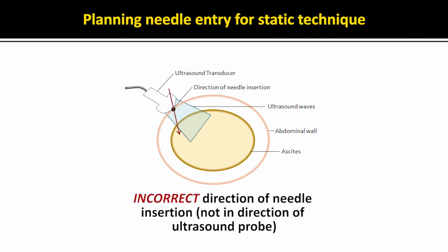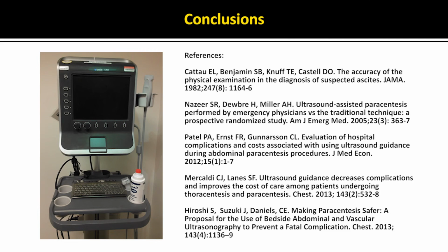One can see in the accompanying figure how easy it can be to misdirect the needle and end up in an area of abdomen that was not visualized by ultrasound. In summary, ultrasound guidance for paracentesis provides information that is not gained by physical exam alone. It likely reduces adverse events and failed procedures, or dry taps, when used correctly, and reduces expenses and avoids the transport of unstable patients compared with having radiology mark the location.